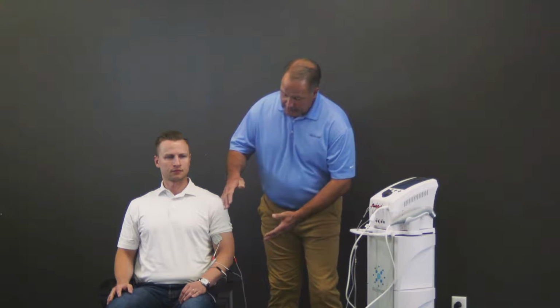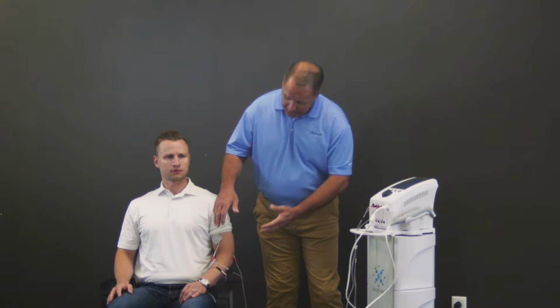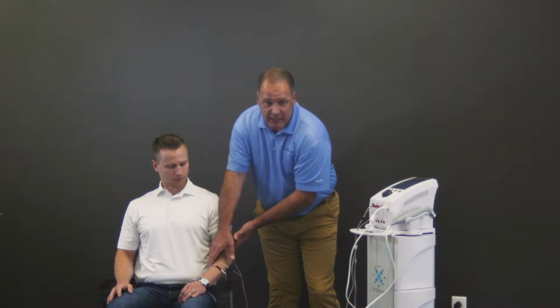Another part of the protocol that allows a much more effective treatment is that all manufacturers have some form of vector scan. They may call it something else, but effectively it's sort of like your car stereo. When we get a brand new car, we usually adjust the fade or the left and right, so we put more sound to the back if you're a rock and roll person, or more sound to the front if you listen to NPR. What the vector scan allows us to do is effectively change the amount of power going between channel 1 and channel 2.